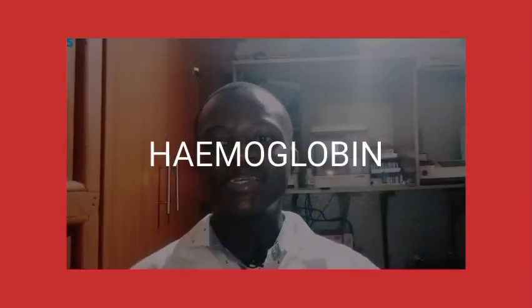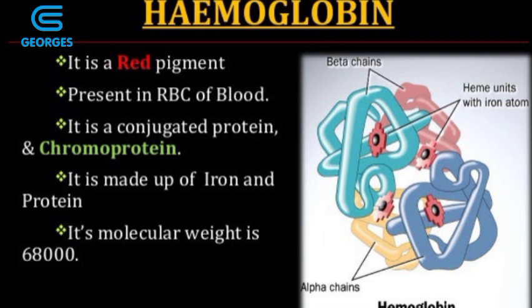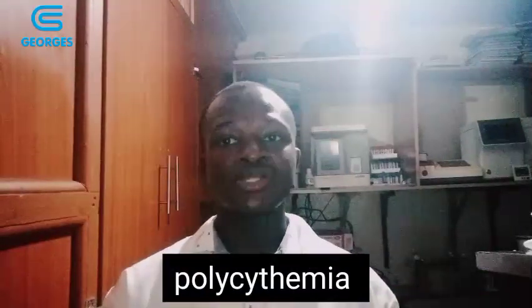Hemoglobin concentration is a measure of the amount of hemoglobin in peripheral blood. This reflects the number of red blood cells in the blood. So what is hemoglobin? Hemoglobin is basically 90% of what is contained in the red blood cell. An increase in hemoglobin concentration can sometimes be due to a condition called polycythemia vera, whereby your body constantly produces a lot of red blood cells.